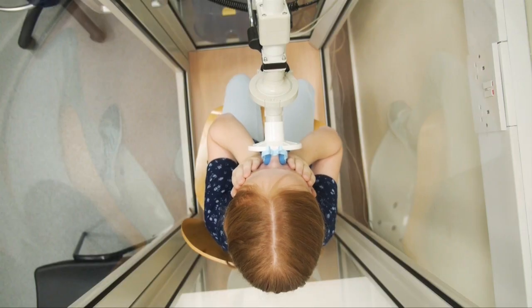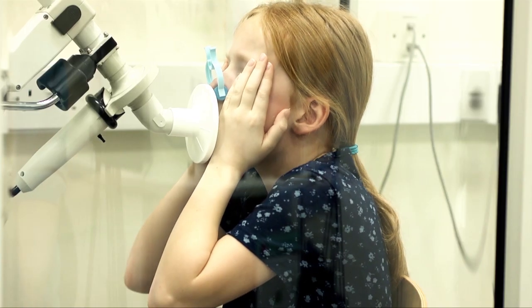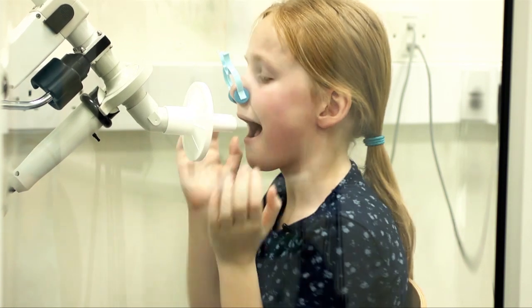Empty your lungs — squeeze, squeeze, squeeze. All the way out and a really big breath, all the way in and all the way out, as long as you can. Squeeze, squeeze, squeeze. And off you come and have a rest.